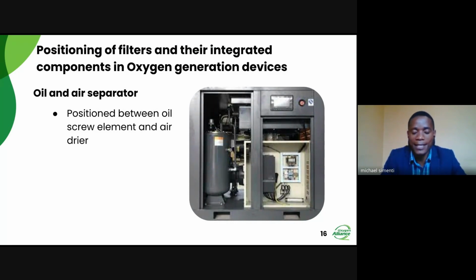And at the same time, the material that has been used to make this tank is a material which can withstand the pressure coming from the compressor. You agree with me that the pressure coming from the compressor is so high, so the material should be able to withstand that pressure.